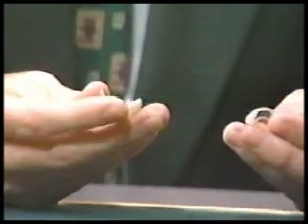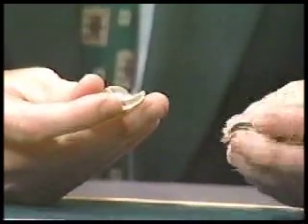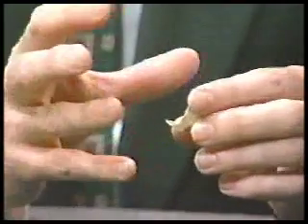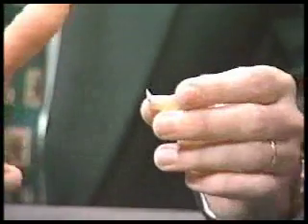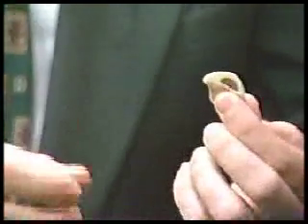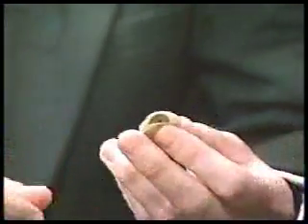Now, I can say that in the old days when people did wear those, sometimes they would actually explode. That's right. From the change in temperatures or things. That's right. They're hollow, and like a glass, like an ice cube, when you pour water on it, they'll crackle. The temperature changes would sometimes break and crack these right in the person's eye socket.